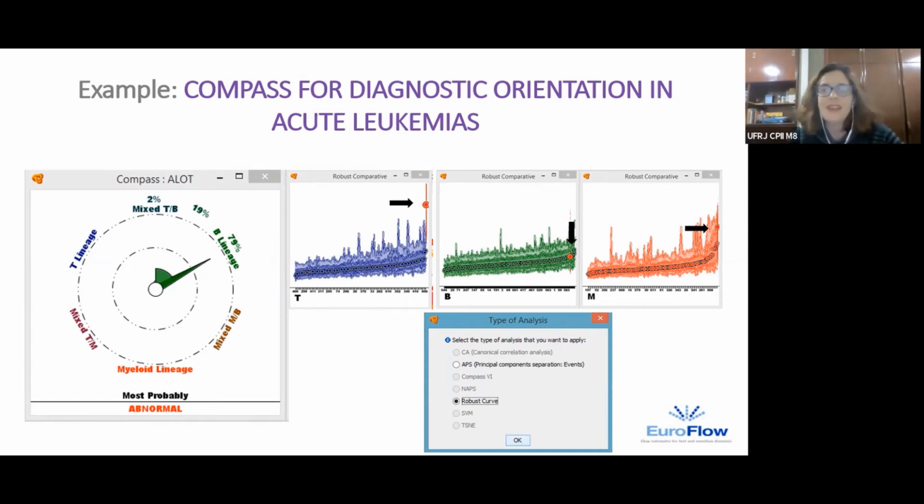So they analyze manually, and afterwards they have to compare with this compass analysis to check their answers. So it's quite nice for learning also. This tool takes a few seconds to run.